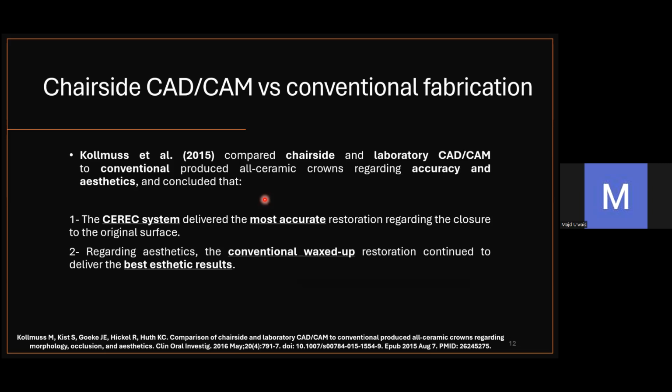So the authors in their study stated that all tested methods produce acceptable results, and it seemed that there is no ideal method to fabricate all-ceramic restorations.